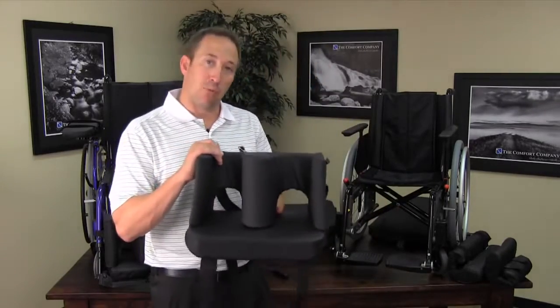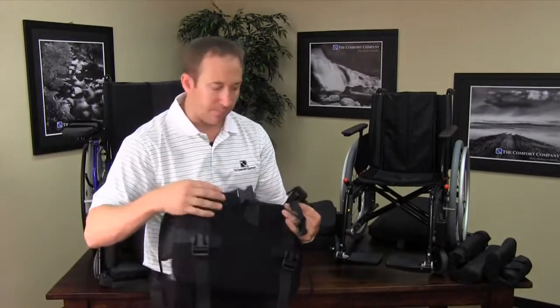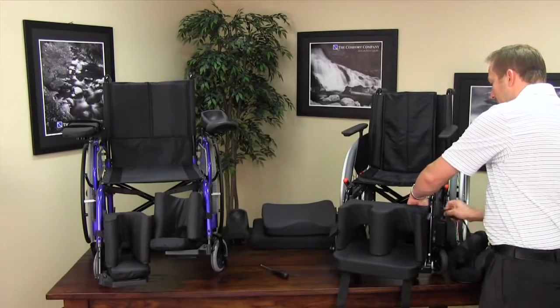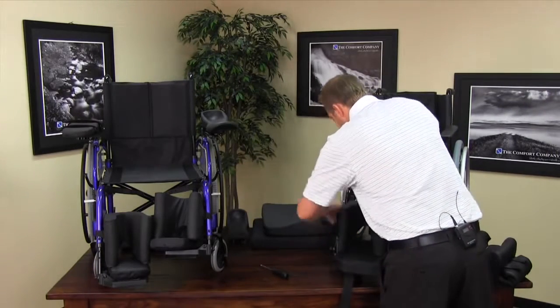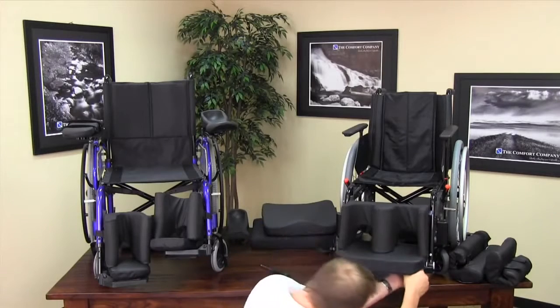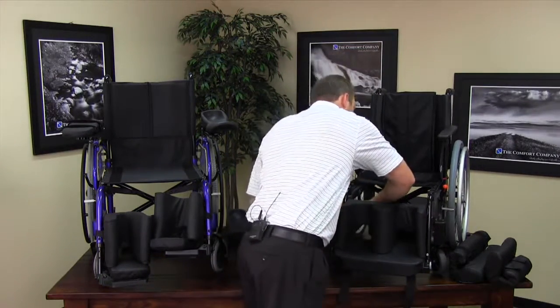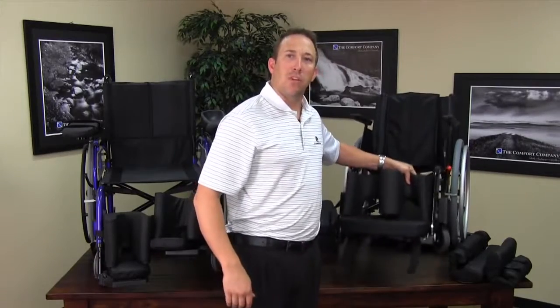I'm going to now mount this product using the buckles. We place the straps around the frame and tighten the buckles underneath the foot plates. At this point it has been installed and is extremely secure for the patient.